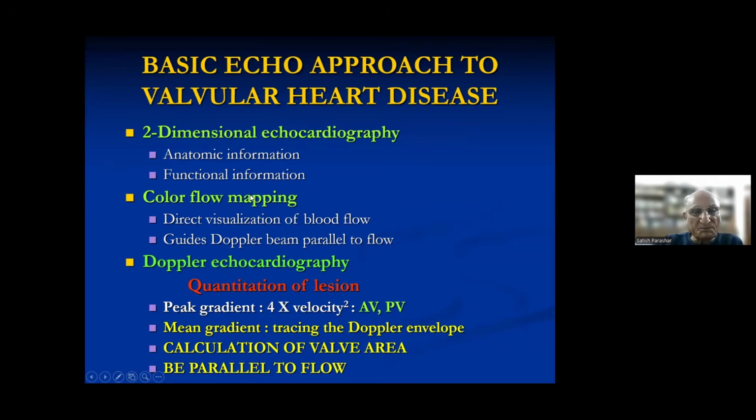So after this we come to color flow mapping, because in any Doppler we have to be parallel to the flow. By now you must know that in a Doppler the main prerequisite is that you have to be as parallel to the flow as possible. And when you see a color, you can always say which side the blood is going, and then you can put your Doppler beam. And this we'll discuss sometime. But every time we have been stressing that be parallel to the flow and take the help of color. That is why we do this sequence in all these cases.